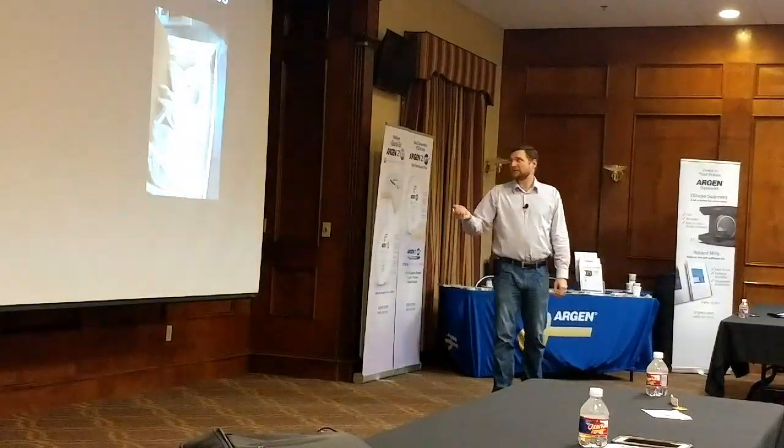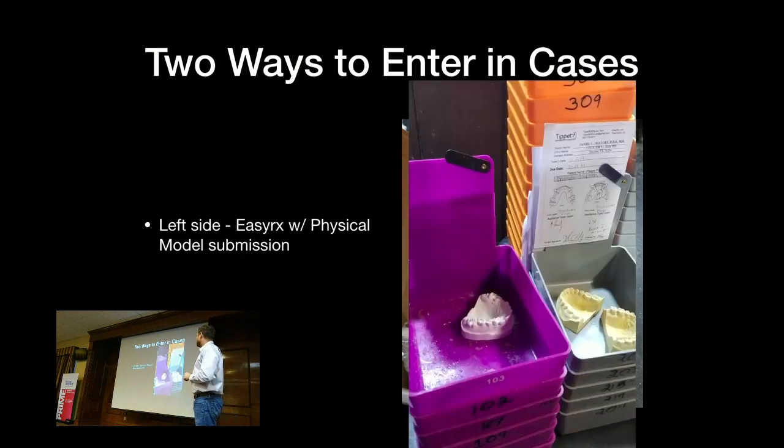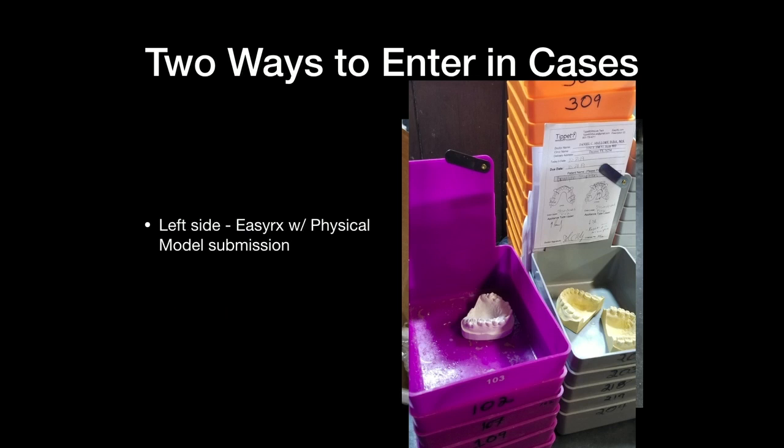So cases come in. This is a box of models that came in, nicely packed. No broken teeth in this one. And as you can see, we put them in case pans with numbers. Everybody use case pans here? There are some ortho labs that just lay out the models on a table and write these instructions on it. I don't know how they do it. Anyway, it's good y'all know what case pans are.